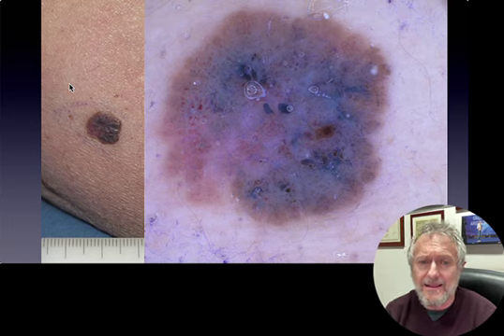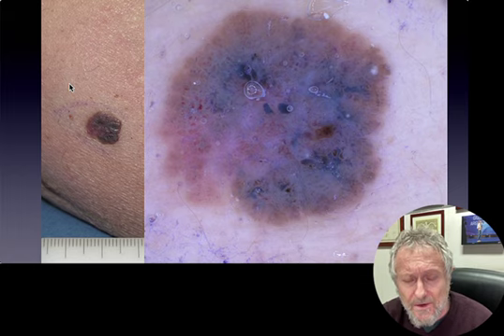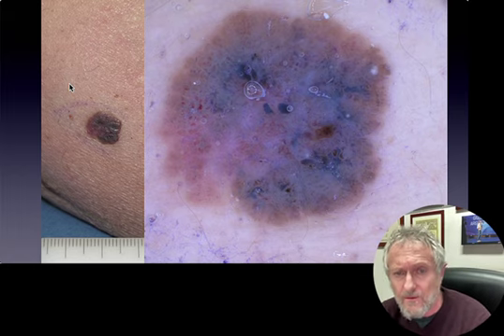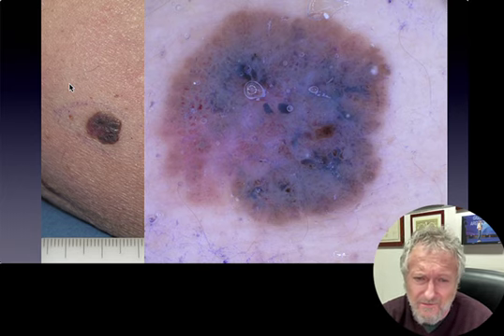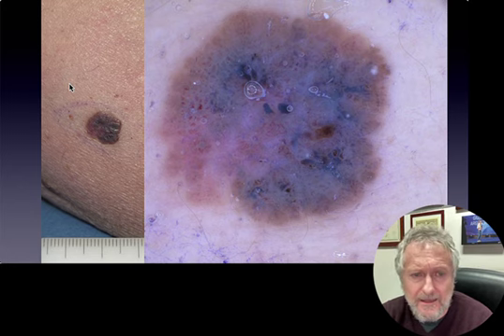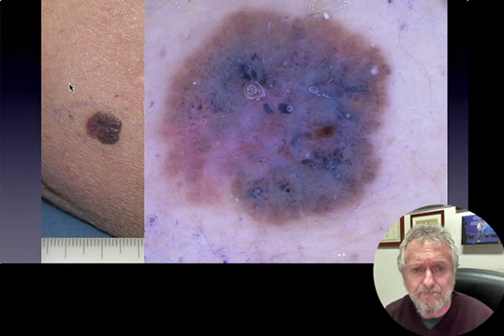Here again, a predominantly bluish pigmented lesion in which we can recognize, together with the blue color, very nice sharply in focus vessels. They are not really arborizing like we expect in basal cell carcinoma, but they are sharply in focus. Therefore, these are the vessels we can recognize in basal cell carcinoma.